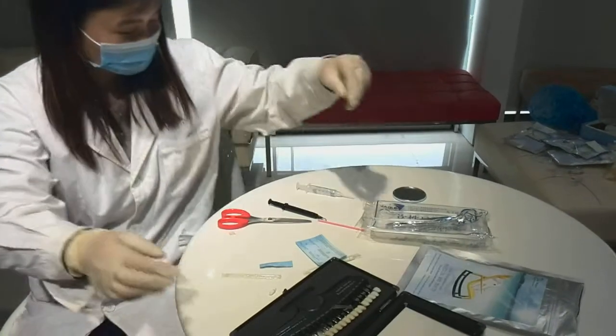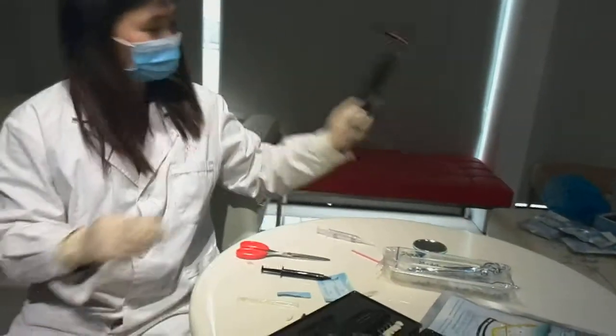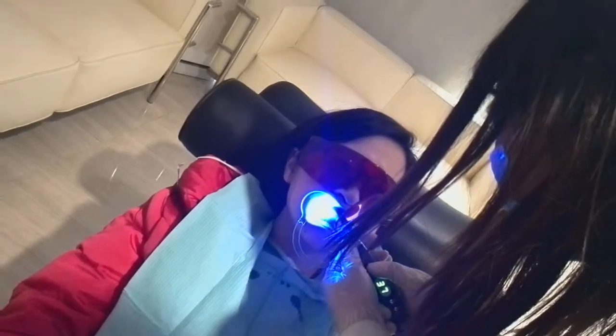But first, we have to put the gum protector on the gum. Then use the LED curing light on the teeth for a few seconds until the resin becomes hard. Remember, make sure the resin completely covers between the gum and teeth.